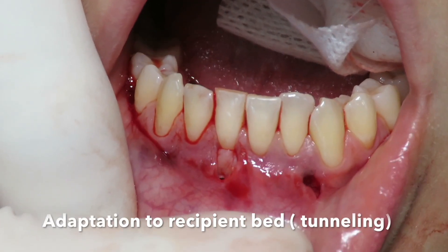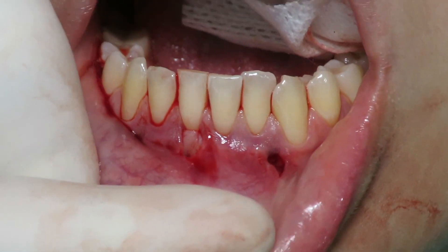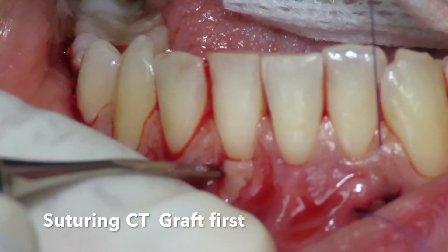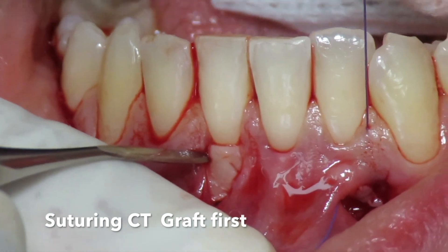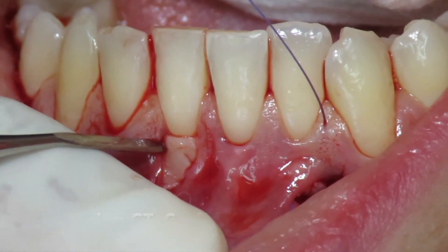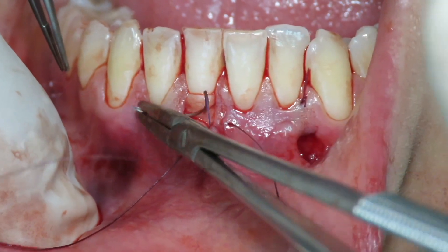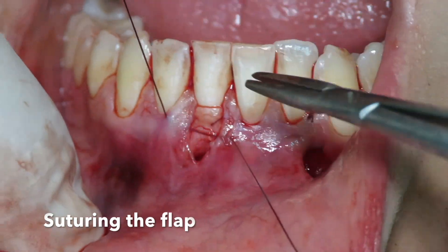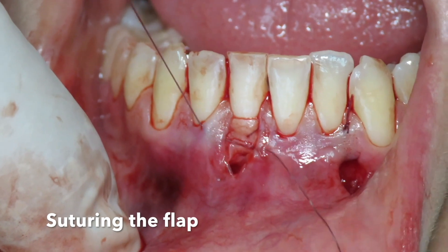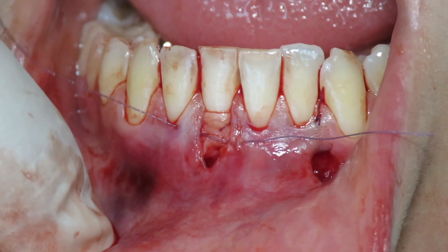Once this is done, we adapt the connective tissue to the recipient bed and suture first the distal part of the graft, attaching it properly to the recipient bed. This is done with 5-0 Vicryl sutures. Once the graft is tucked in and stabilized properly with thin sutures, we suture the recession itself.